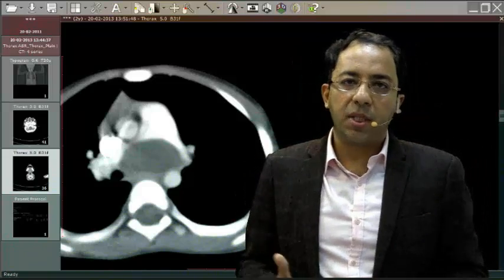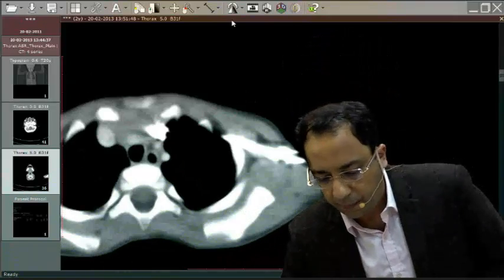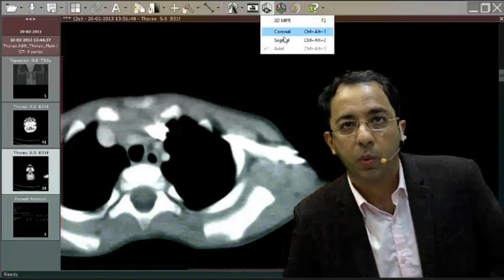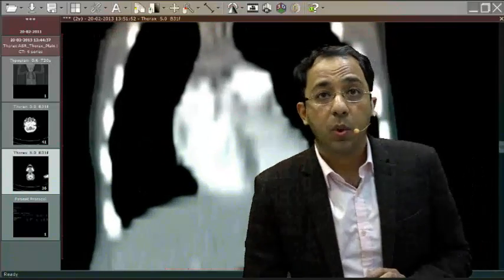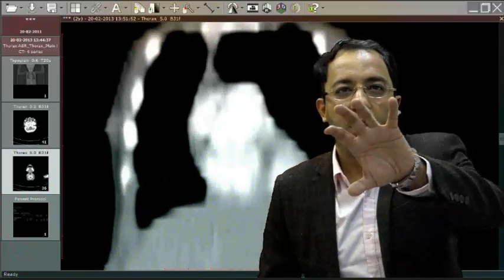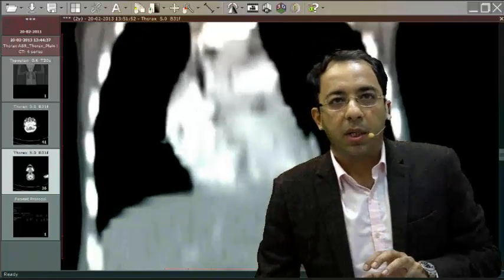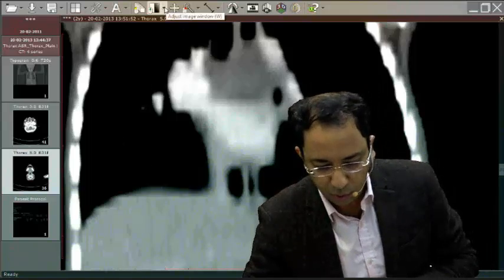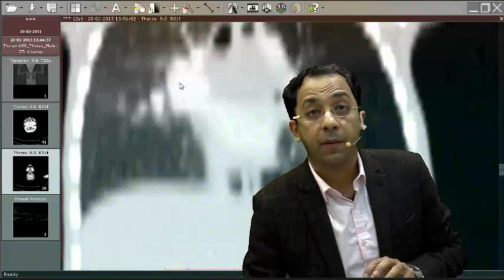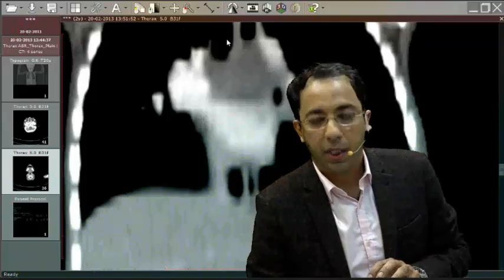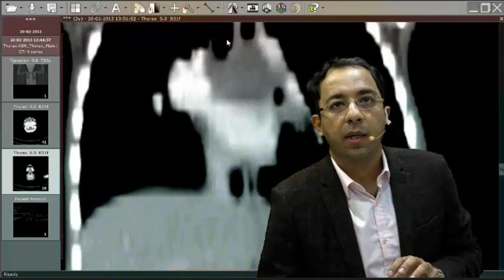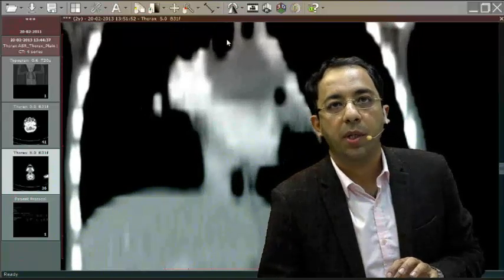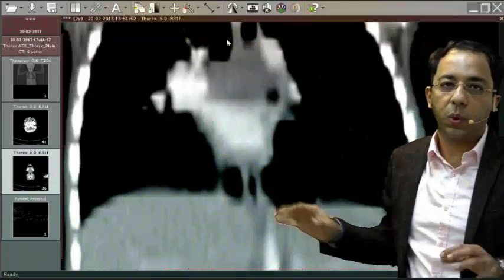Now, let me create an MPR for you. Let's create a coronal MPR. As a resident you are supposed to look at the multiplanar reconstructions as well. They will give you some idea. You can actually appreciate the hyperinflation in this particular image. And when I go down at the level of the carina, let me change the window to the lung window and to the mediastinal window. This is that cystic lesion that we saw at the level of the carina. You can see the right bronchus and you can see how it is partially obliterating the left bronchus, and that was the reason for this. This is the coronal reconstruction.